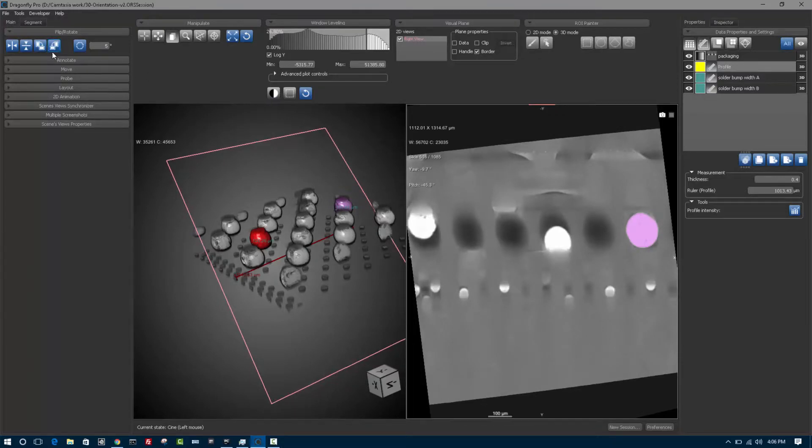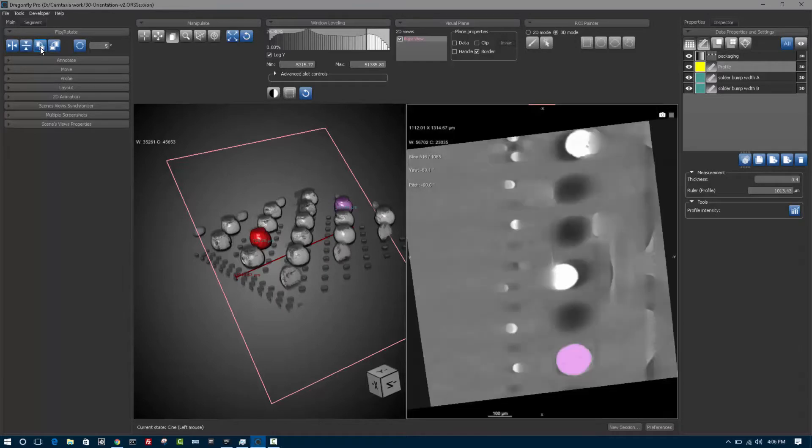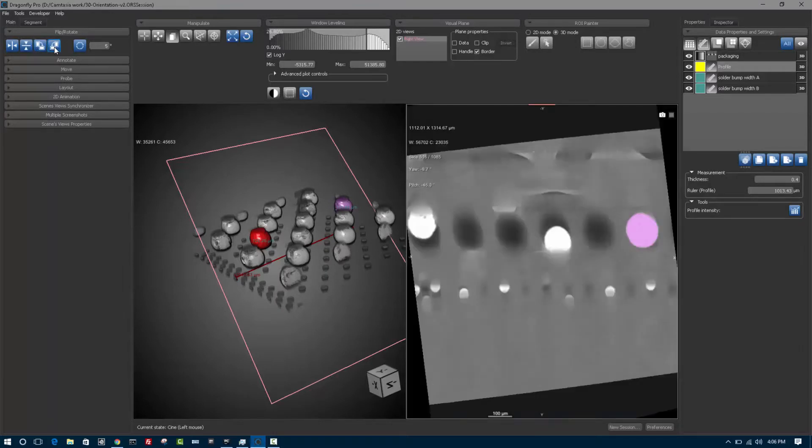The blue buttons are action buttons. They allow you to affect a singular action without changing the state. So for example, if I'm looking in this view and I want to rotate 90 degrees, I can perform that or I can unrotate backwards the other direction 90 degrees, but I'm still in the cine state.